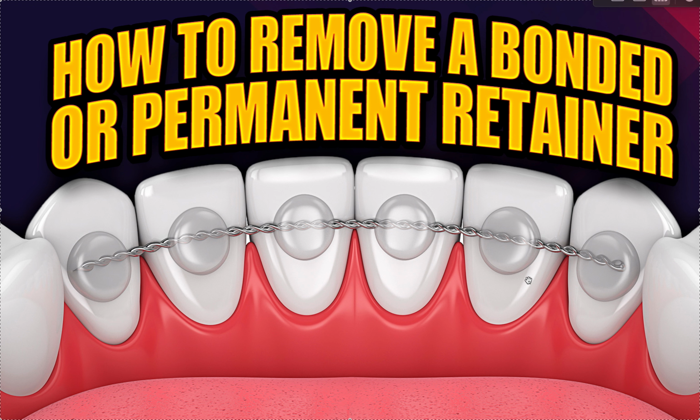As you're getting closer, you're using finer and finer burrs, greenies and brownies, to take it off, white stones. You really shouldn't be taking off any enamel if you're doing things properly.